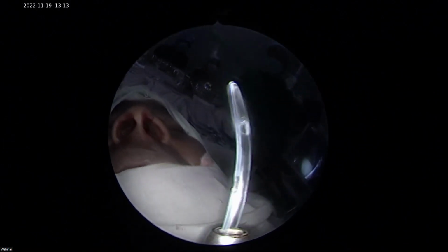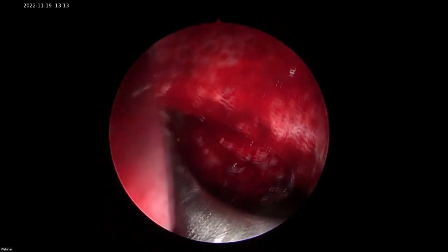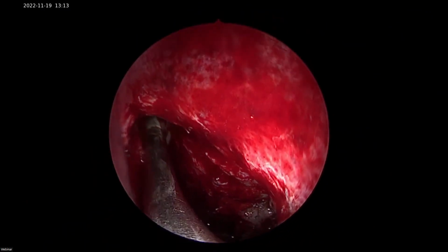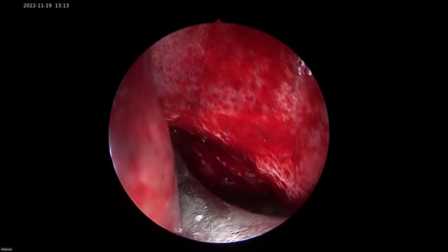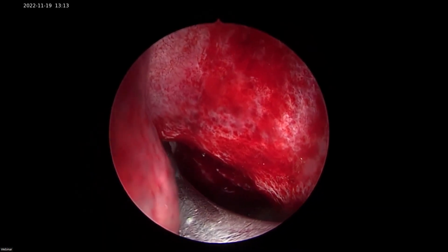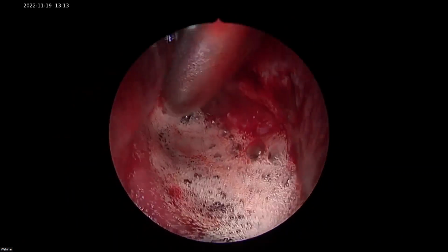So what we have done is we have taken the curved section and I have put an oxygen catheter through that sinus. Slightly remove. पूरा अंदर ले ले बस. So now I'm introducing it. Push the catheter. Put and flush it now. इसका opening किधर है? चलो करो, जोर से. Mission successful.